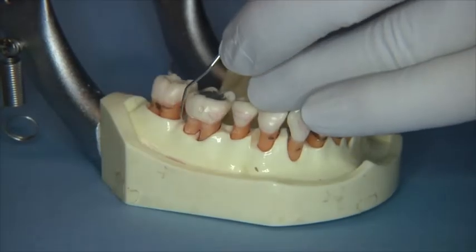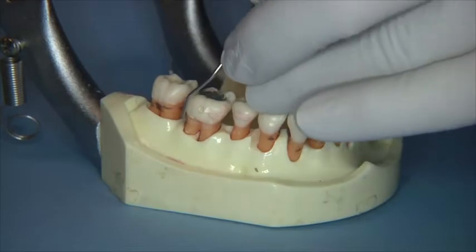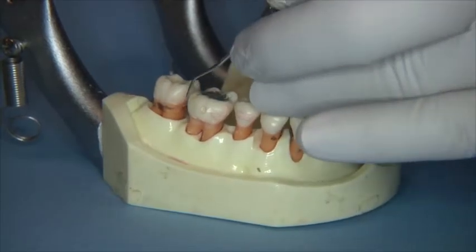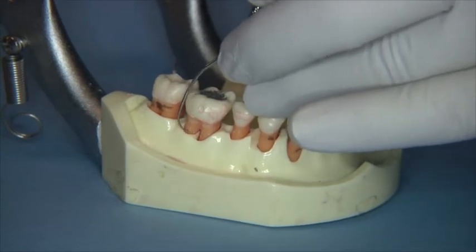Thus, it is beneficial that dental hygiene students learn how to effectively use the ODU-1112 Explorer to locate subgingival deposits and re-evaluate tooth surfaces during instrumentation.